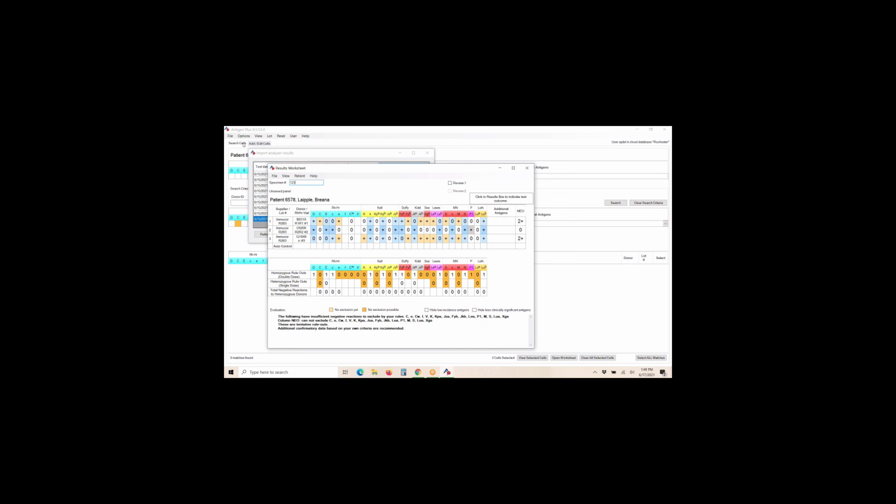We'll talk about the mechanics of the interface after Alex gets done, but yes, you can get the results from the blood analyzer to flow straight into Antigen Plus and create these kinds of panels. Which is a really nice feature if you want to get those results into Antigen Plus, and then you're not having to type everything in like I did on the manual example. So here, this is a Neo screen, and you saw the results came over, and it had that sample number, and I picked my patient and I put the specimen number. If I put a wrong specimen number, it won't link the two together. So as long as you're using sample numbers that are unique to a patient, then you should be fine. That's the check.